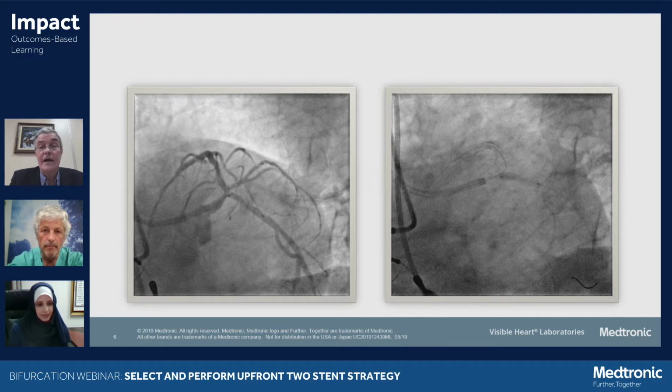So I would probably do the same, and maybe slightly different in that I would start stenting from the left main into the circ, but these are all variations based on operator skill and personal preference. So if you can now lead us through the steps of double kissing crush, I think that will give new tips and tricks, but also topics for questions and discussion.